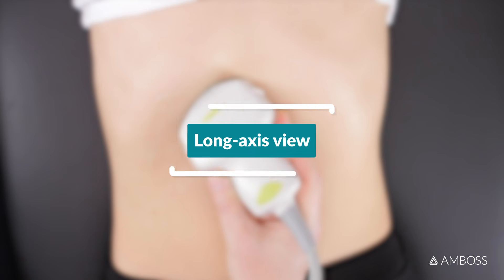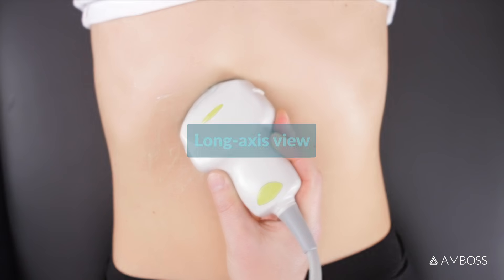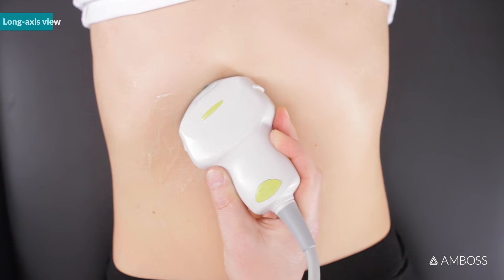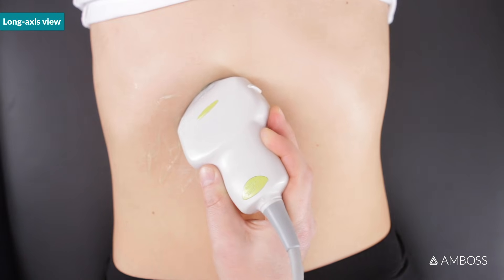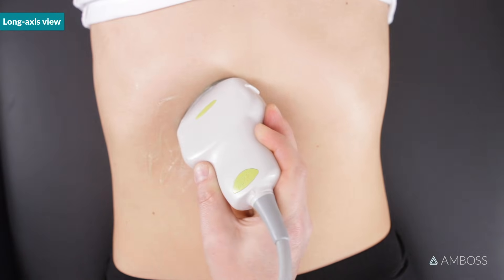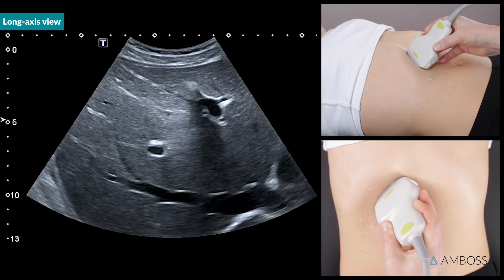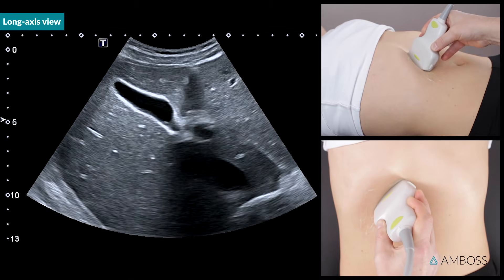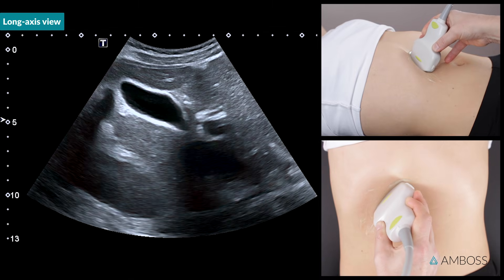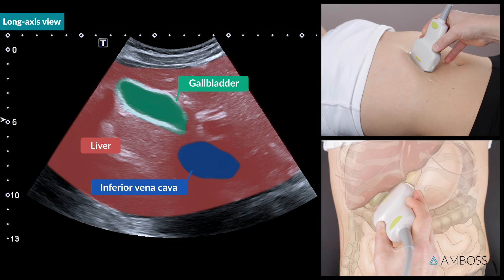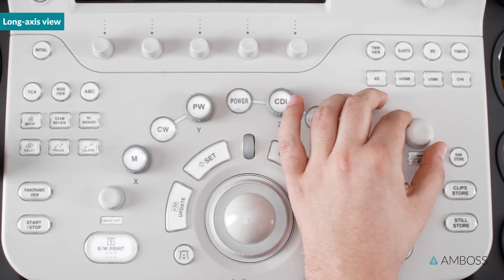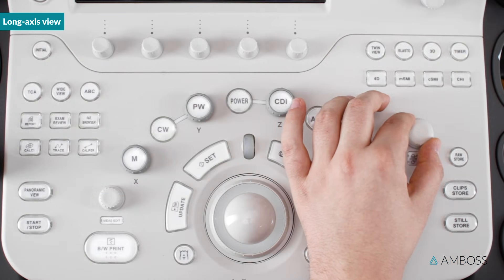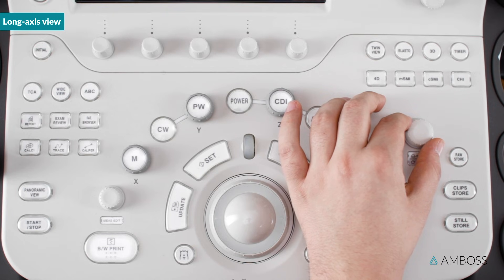Long axis view. Begin with your probe placed below the costal margin, just to the right of the midline. Tilt the probe to fan through this region and locate the gallbladder. It may be necessary to adjust the depth at this point.